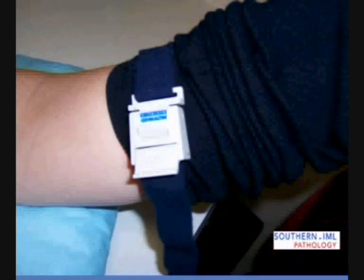Ensure there isn't any restrictive clothing above the tourniquet. This is especially important in winter. If the garment is tight, request that the client remove their arm from the sleeve before you attach the tourniquet.